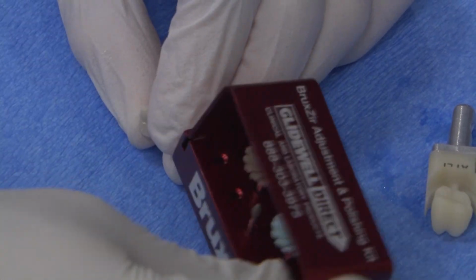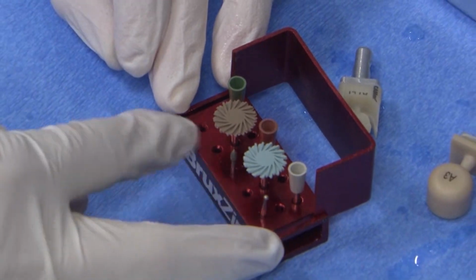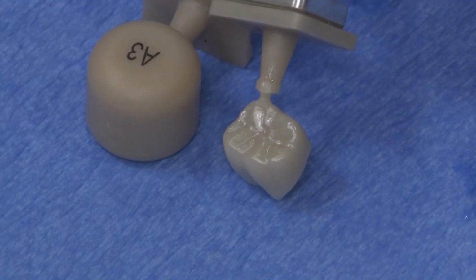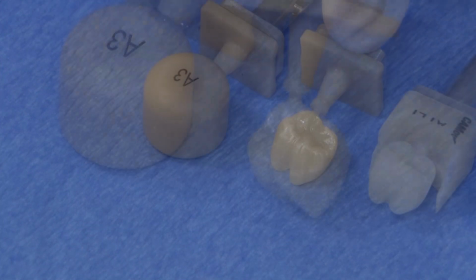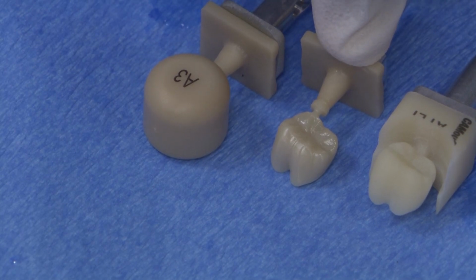And now this is the BruxZir adjustment kit. So this kit has diamonds on the front row and polishing wheels. I'll show you the polishing after. Really incredible that the mill is able to do that. The timing for this one was 36 minutes. So I'll show you what we do to get this ready to try in.